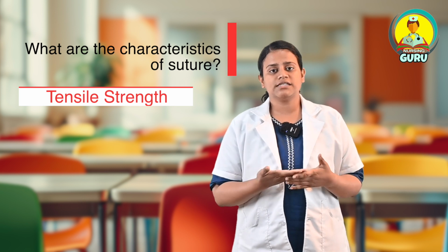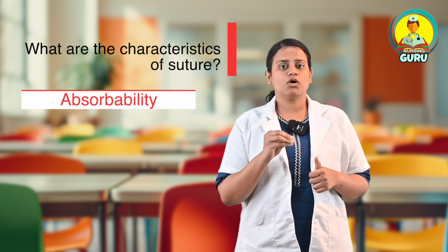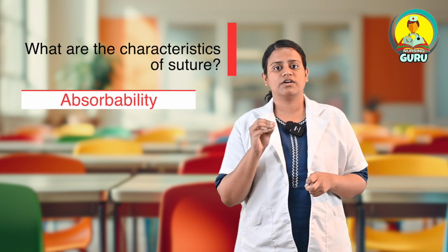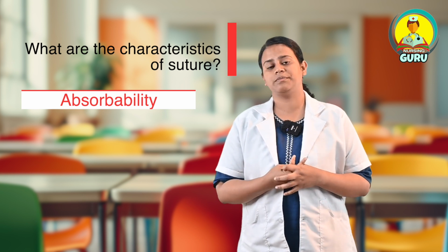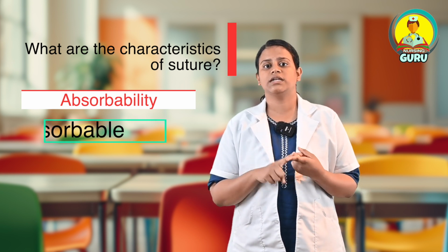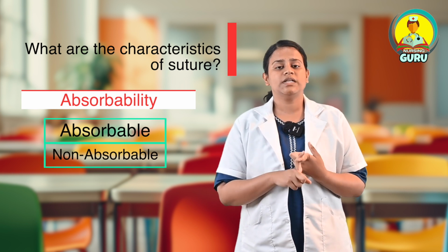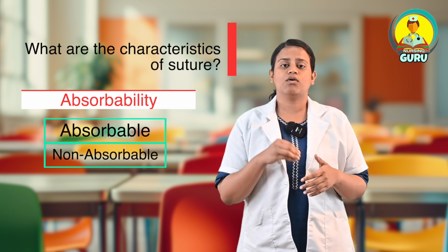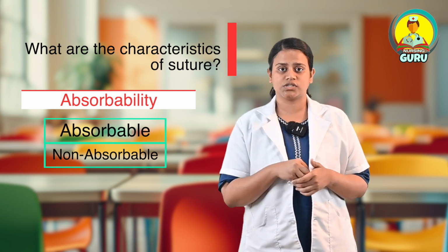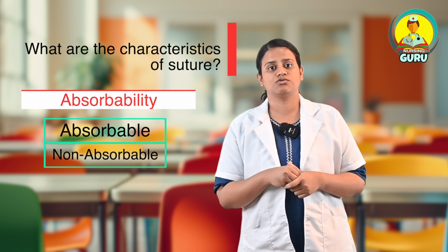The last characteristic is absorbability. Absorbability is also one of the characteristics of a suture material. There are two types: absorbable and non-absorbable. Absorbable is used only in wounds that are deeper, or where there is a mucosal layer, or where we cannot open the wound again to remove the suture.